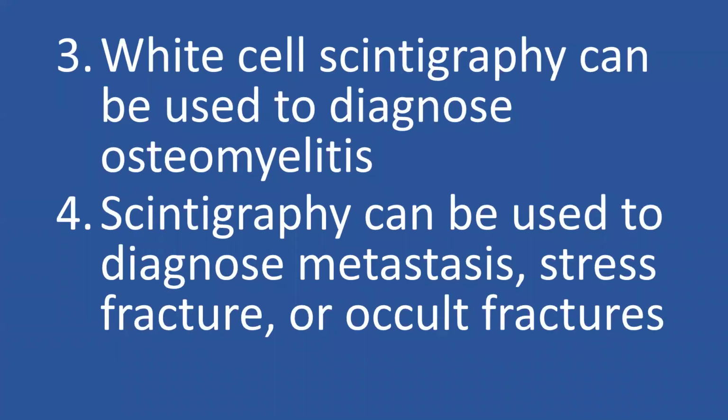White cell scintigraphy can be used to diagnose osteomyelitis, as I spoke about gallium and indium-111. Scintigraphy can be used to diagnose metastases, stress fractures, or occult fractures.